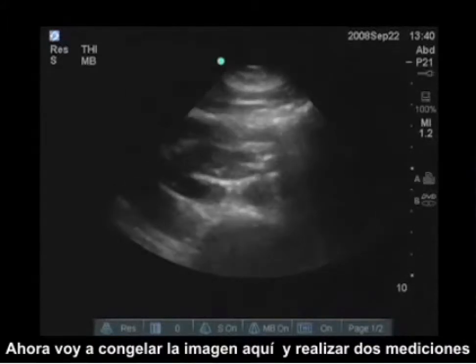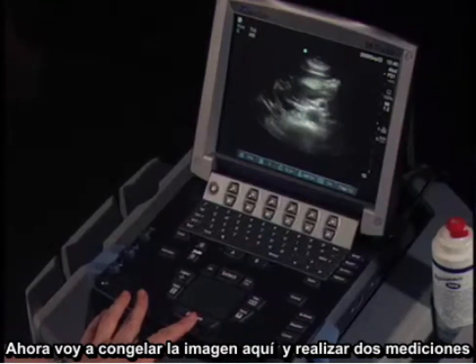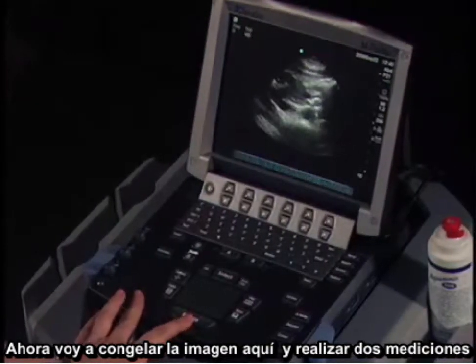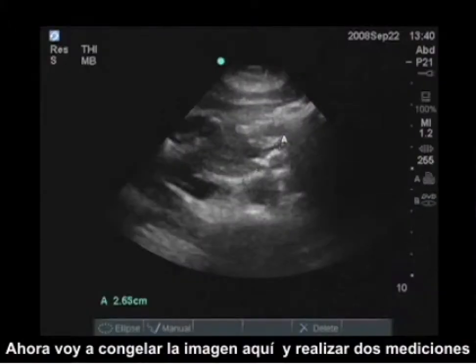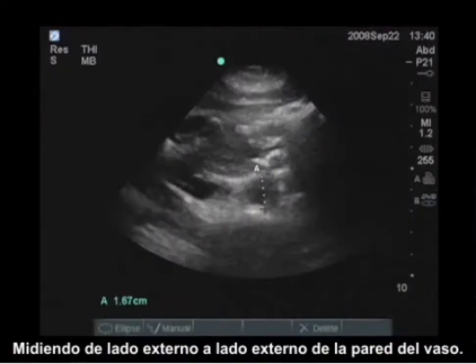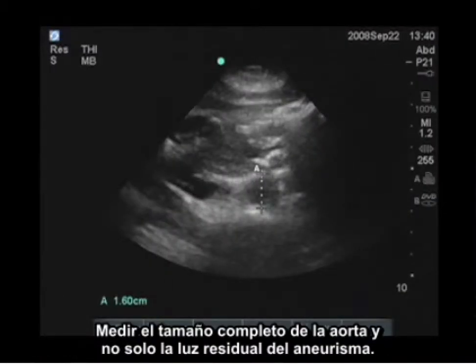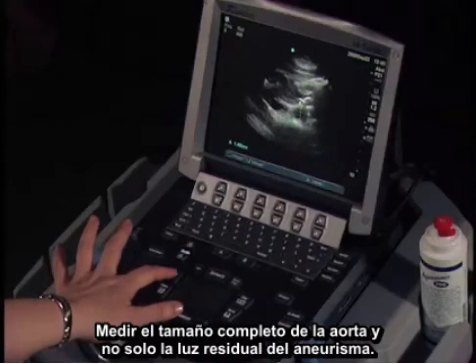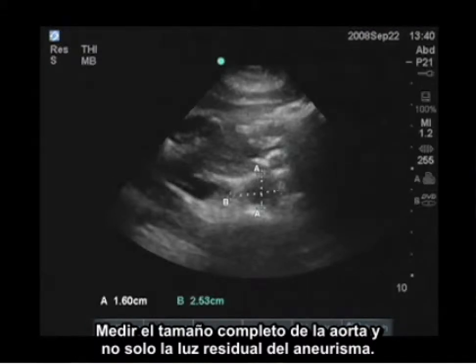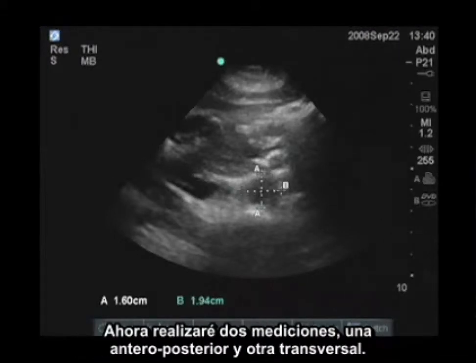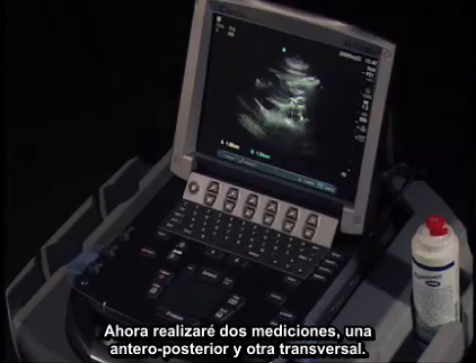I'm going to freeze the image here and perform two measurements, measuring from the outside wall to outside wall, so I measure the entire size of the aorta and not just the residual lumen of an aneurysm. I will perform two measurements: anterior to posterior, and a transverse measurement.